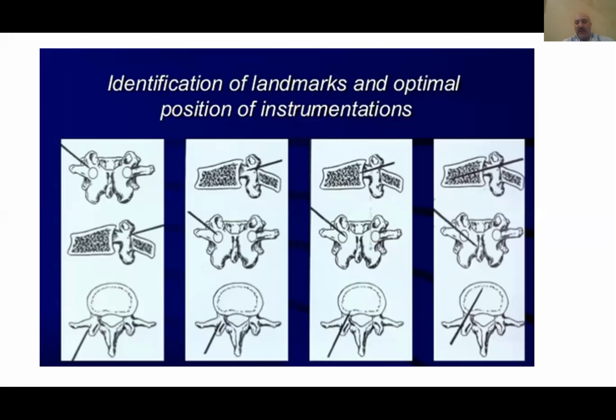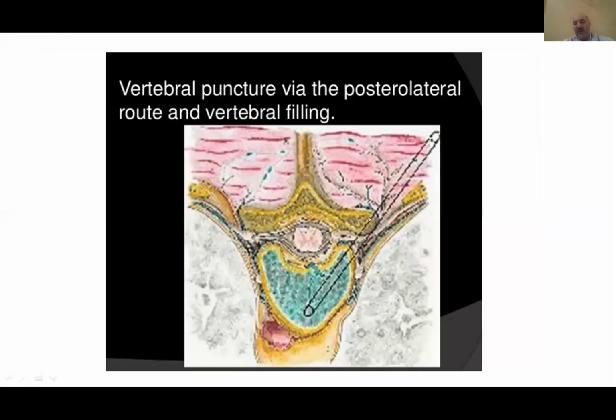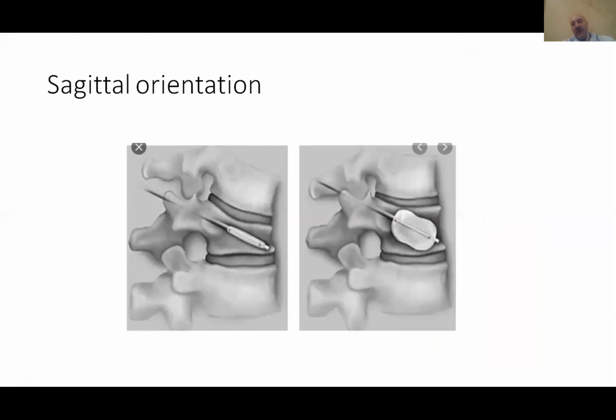There is also an additional technique. If you can't find the pedicle, or the pedicle is broken, you can go even from a posterolateral or far lateral trajectory. It is similar to the in-out-in technique, which we use in scoliosis, and this is also very safe. But as I mentioned, with these techniques you have to get trained first with the lumbar and lower thoracic levels, before you go to the upper thoracic level.